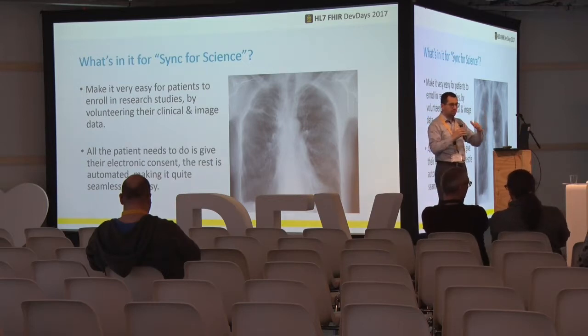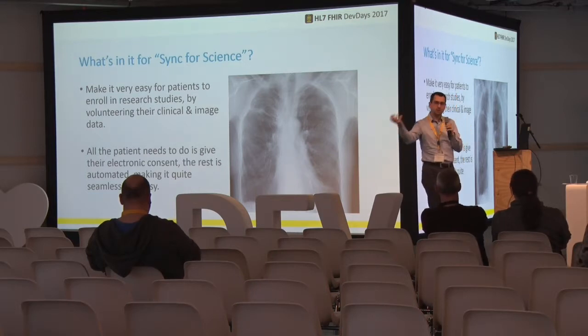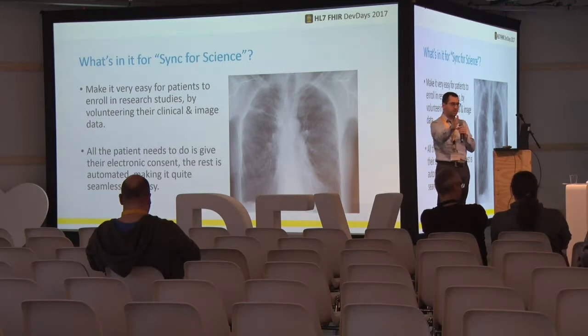So by making this implementation, all the patient needs to do is say yes, and then they can use all these RESTful APIs to pull, whether from FHIR or DICOMweb, and the whole thing just works really beautifully. The idea is they would install this proxy service at the different institutions, and then they could pull over the internet.